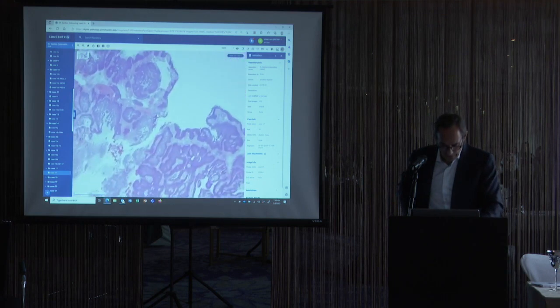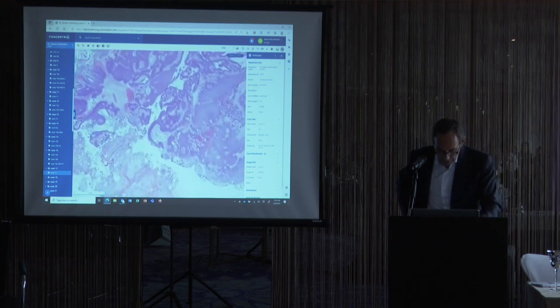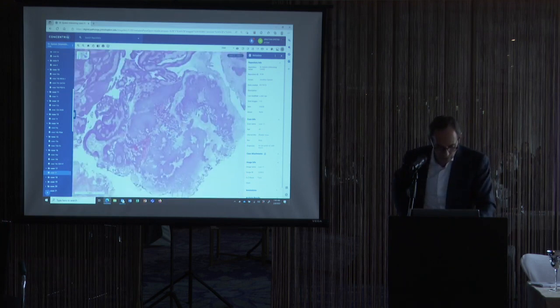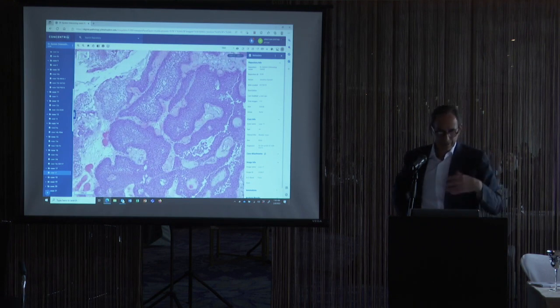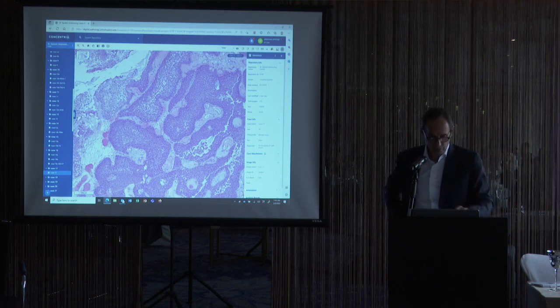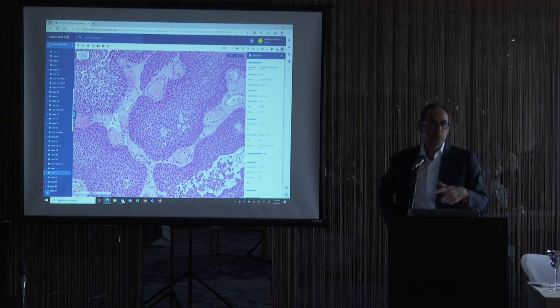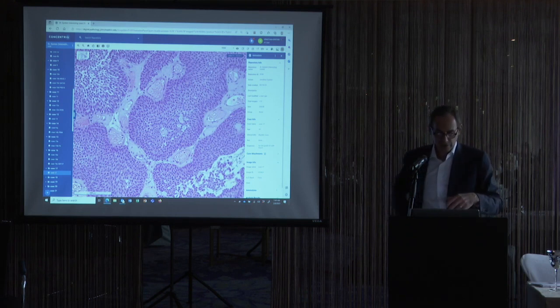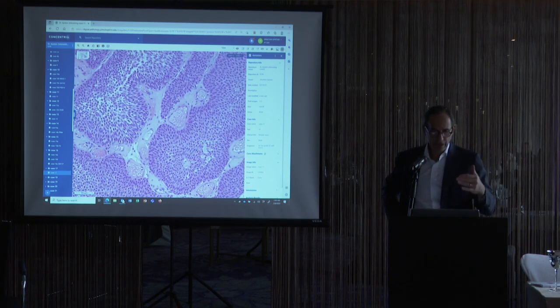But the interesting thing about this tumor is in the areas of this tumor, let me find the best area. With many papillary urothelial cancers, it's very common to have an inverted growth pattern. I would say it's just as common as the exophytic component. But with an inverted growth pattern, the inverted growth has a very rounded, smooth border to it, not irregular. There's no stromal reaction. There's no what we call paradoxical differentiation, where the tumor gets pinker when it invades. So right now in this field, this is all low-grade, non-invasive papillary urothelial cancer with just an inverted growth pattern.